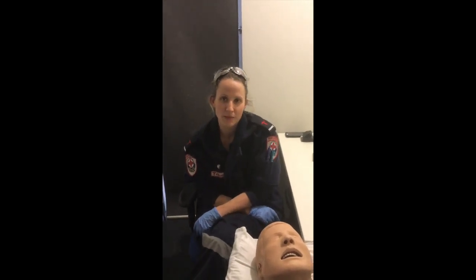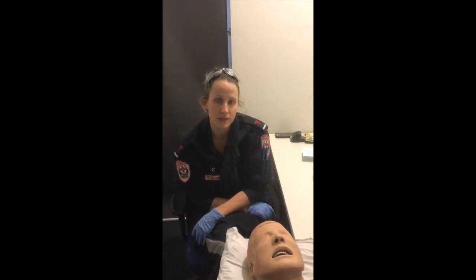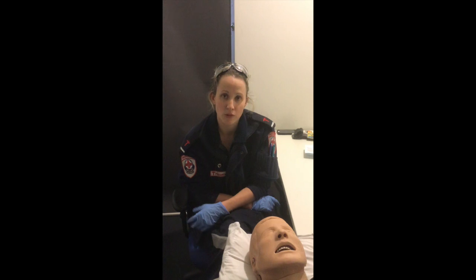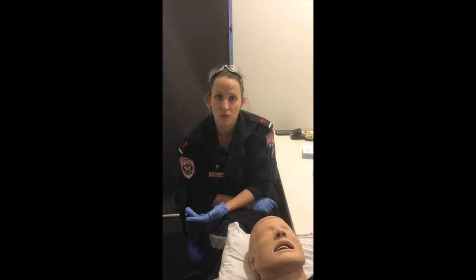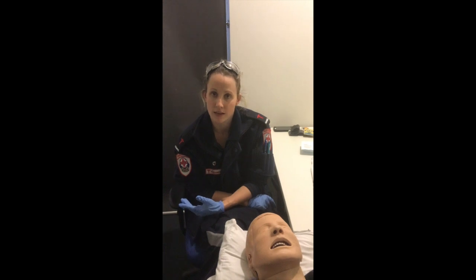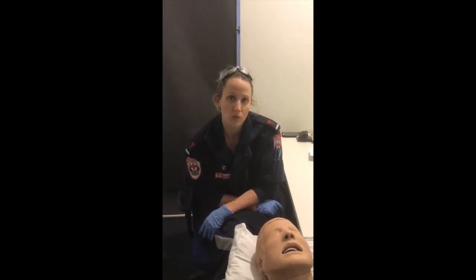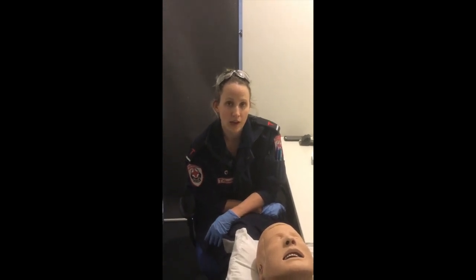We're going to run through an approach to a failed airway. So some of the things you might look for to identify a failed airway during the strategies you might be implementing would be things such as a poor ability to ventilate, which might be evident with a brick bag, poor seal, no chest rise and fall, no sounds heard on auscultation, as well as things such as declining SpO2 despite oxygenation or attempts at oxygenation, or dropping end tidal or a poor end tidal CO2 waveform might also be indicators that you're heading towards a failed airway.